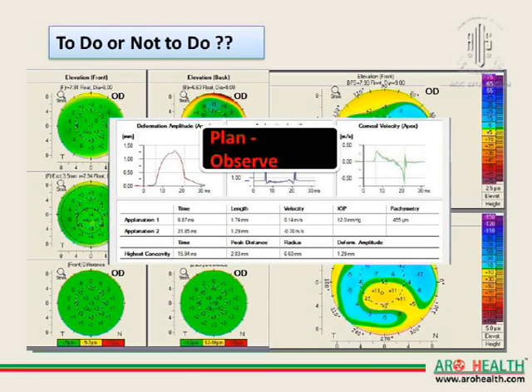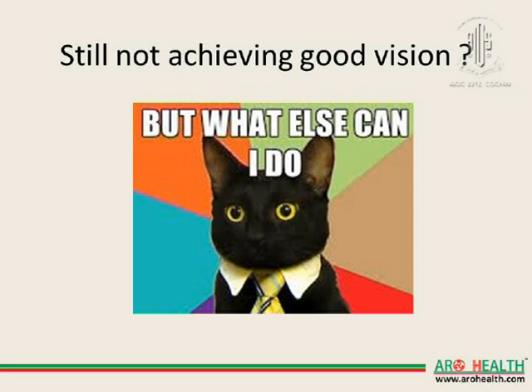With 1.29, I would like you to see the thickness. Can you see 529, 530? With this much thickness, do you expect the cornea to be this weak? We don't expect that, so it's better to observe these patients. Now, you have told the patient who has walked in that you will not be able to do LASIK.